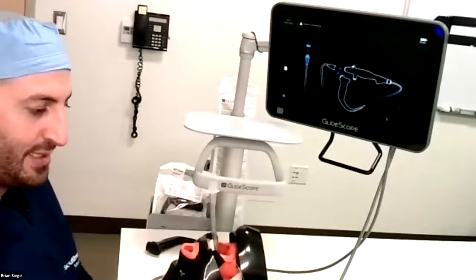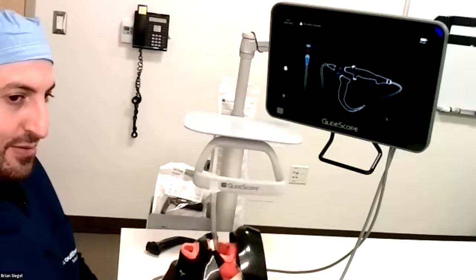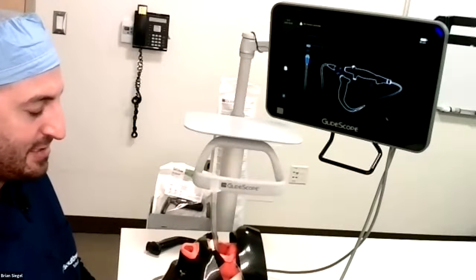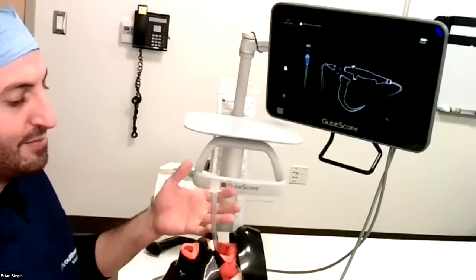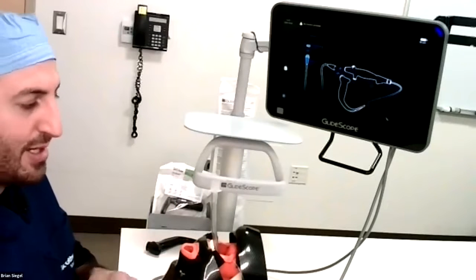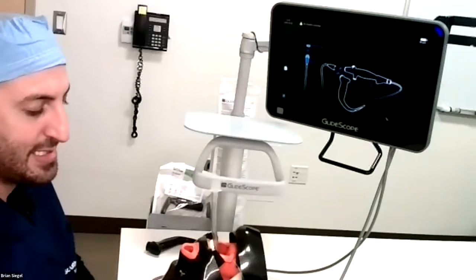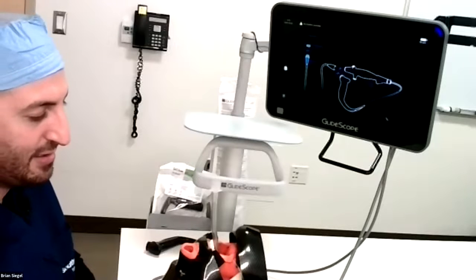This is a really helpful, powerful technique when you have a difficult airway. When you have a great view with your GlideScope blade but, because of that hyper-angulated shape of the blade, you just can't get your tube anteriorly to the view you've achieved — that's where this helps. Using two people allows one person to focus on holding the blade in place and getting that view, which is critical, while the other person focuses specifically on the bronchoscopic portion. When you don't have to multitask, you can focus on each task and it makes for a very successful intubation. There's a higher success rate when intubating difficult airways.